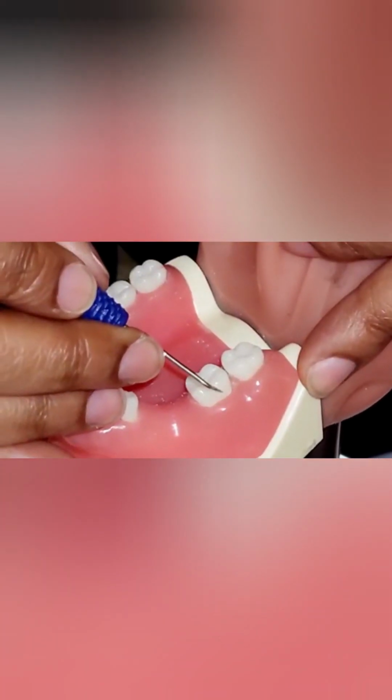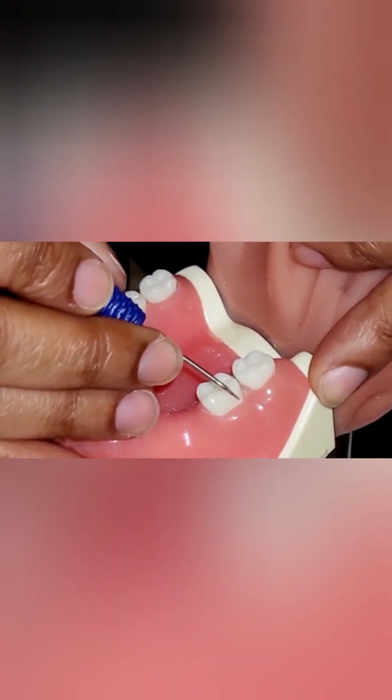So we're going to go over to tooth number 18, which is our second molar.